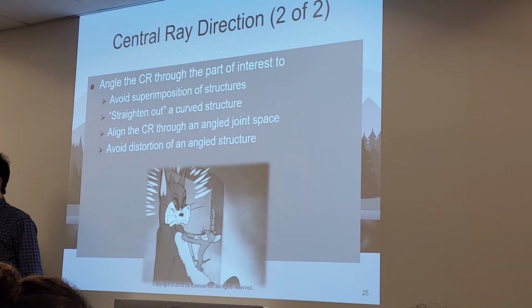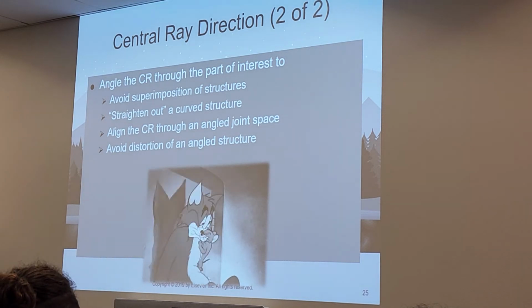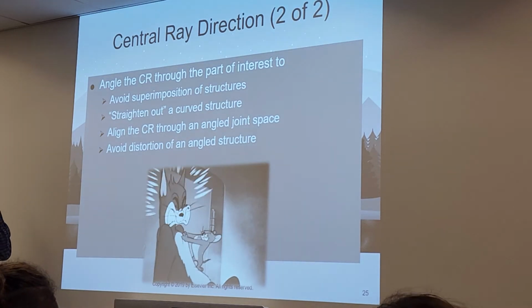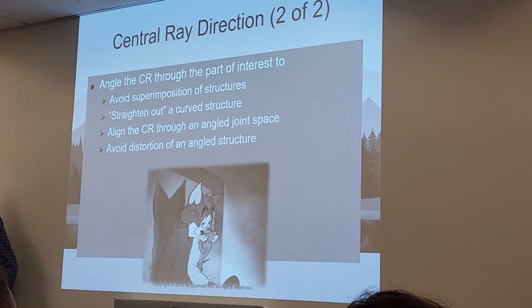And so as you go through these chapters and you start learning about the chest and the abdomen and the extremities, you will learn positions where you need to angle. You will learn positions where you need it perpendicular. Right? And you will need to memorize these.